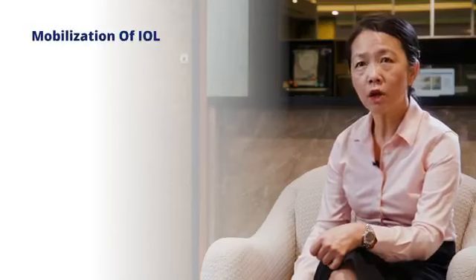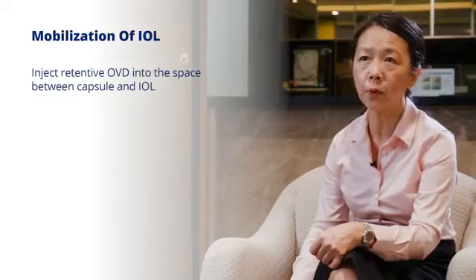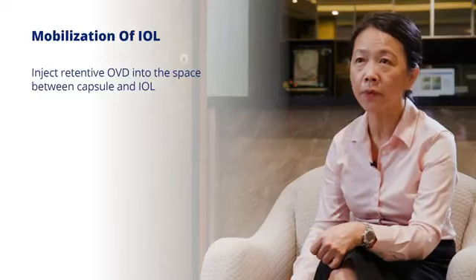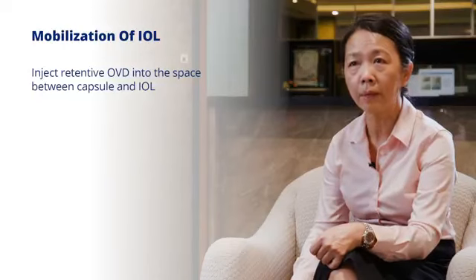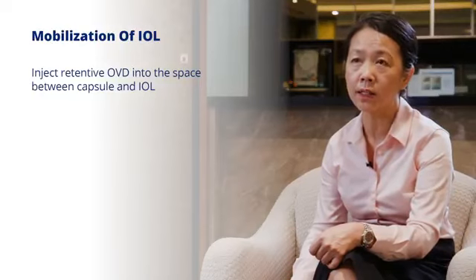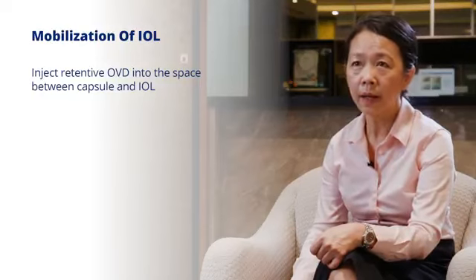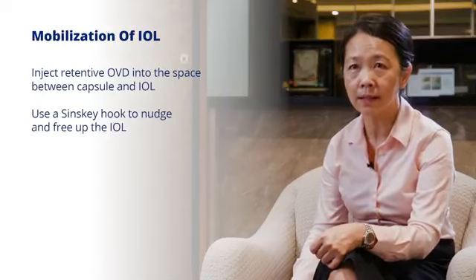To mobilize the intraocular lens, inject retentive viscoelastic into the space between the capsule and the intraocular lens. This may be difficult if this is being done more than a month after surgery. You may need a second instrument to help you to pick up that lens capsule edge before slipping the cannula of the viscoelastic under that capsule. Use a Sinskey hook to nudge and to free up the intraocular lens.